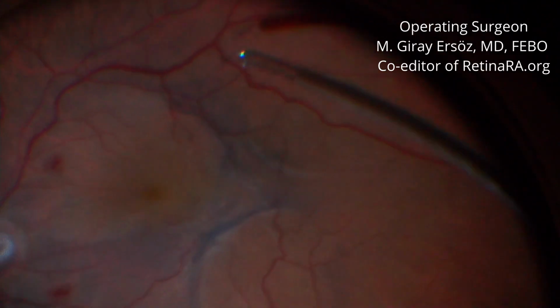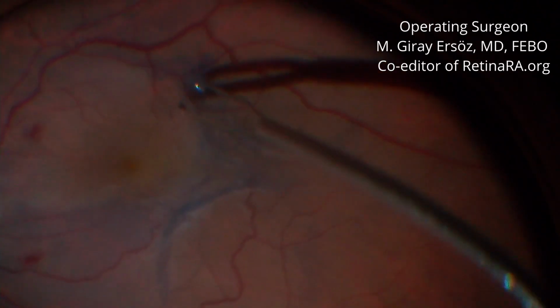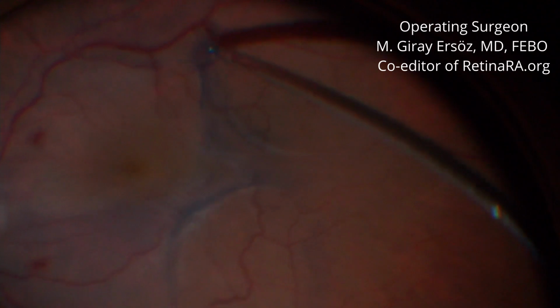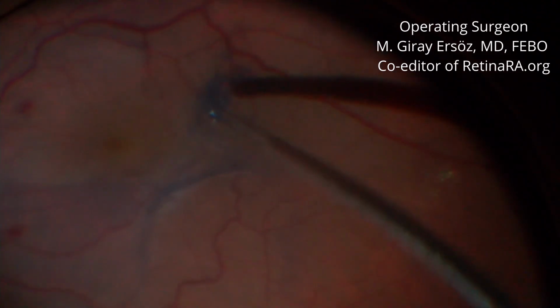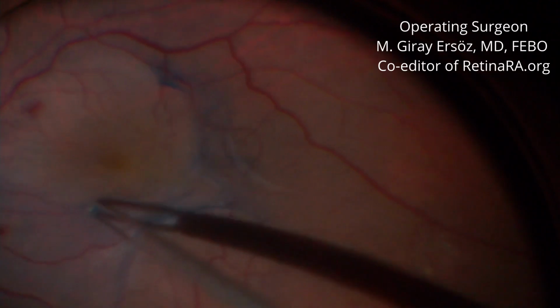It is crucial not to persistently apply traction at the same point. As demonstrated in the video, there were moments that I grasped the membrane, recognized excessive retinal traction, and released the membrane. The primary objective was to avoid inducing tractional injury.